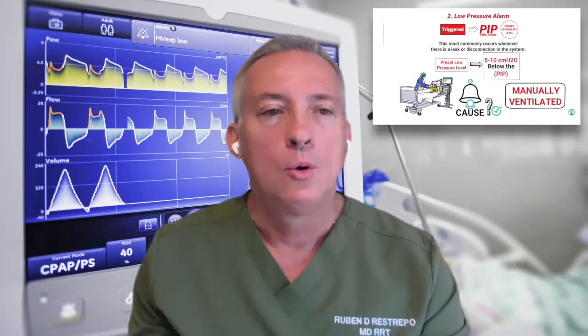The high minute volume alarm will change once the patient starts breathing. So that could be a moving target, but not so much the low minute volume, unless I reduce the mandatory rate.